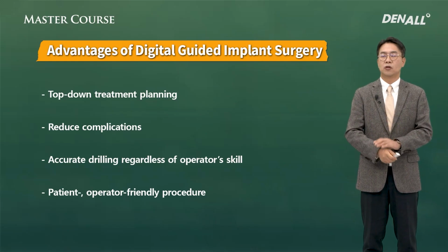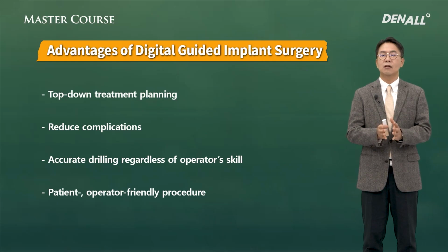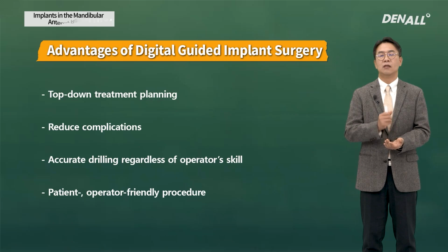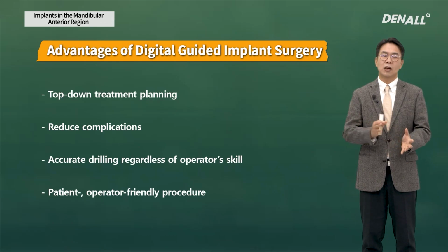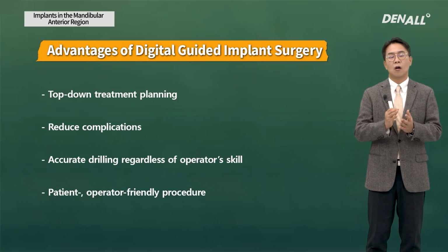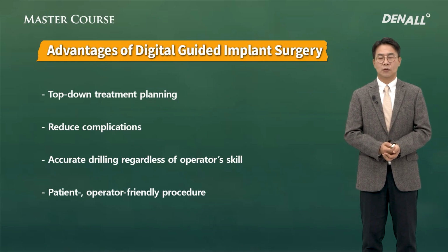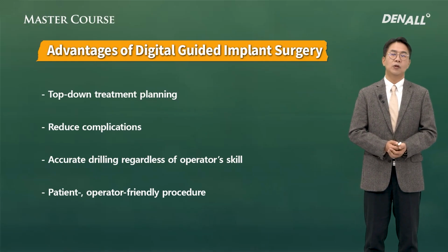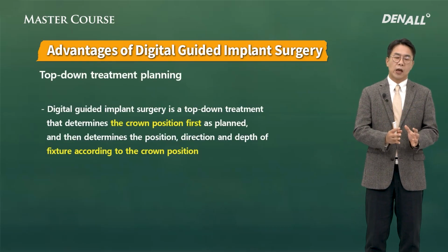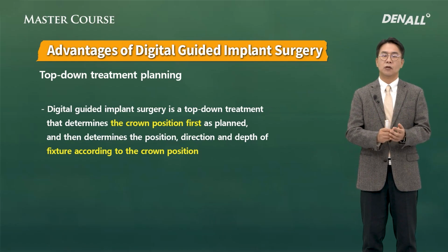and the guided surgery system is the answer for accurate positioning. The best benefit of the guided surgery, which is different from the surgical stent, is that the drilling is not determined by the clinical experience of a surgeon. That is the best differentiator. Of course, it increases the benefit to patients as well. So what we do is performing the treatment plan. So treatment plan should be established first.